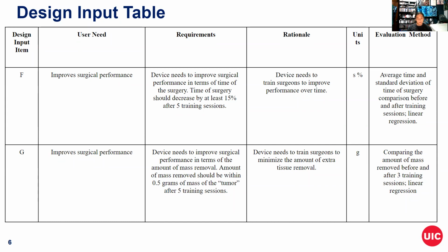The rationale behind all of this is that the device needs to train surgeons to improve their performance in accomplishing the surgery while also minimizing the amount of extra tissue removed. Our evaluation methods are as follows. The average time and standard deviation of the time spent conducting the surgery compared before and after each training session. The time should be improved in a linear regression, and after 3 training sessions, the amount of mass removed before and after should improve also in a linear regression.